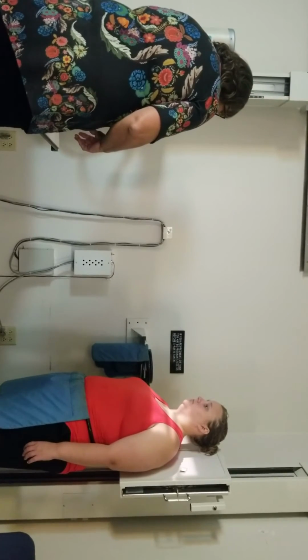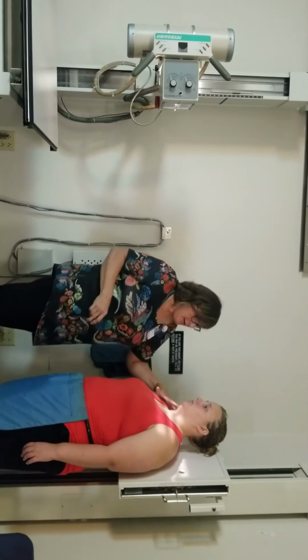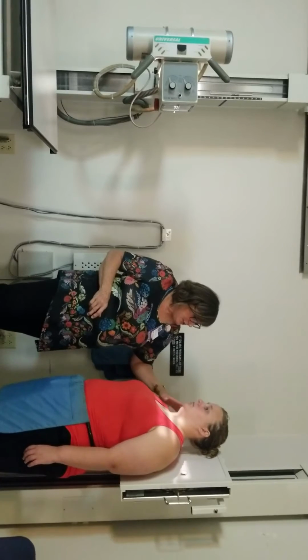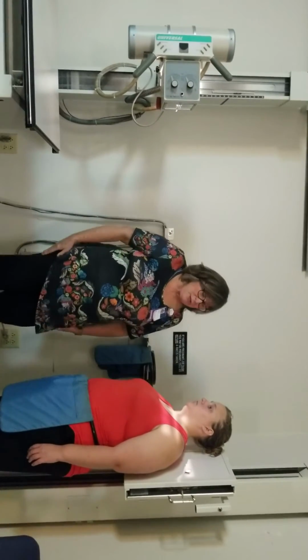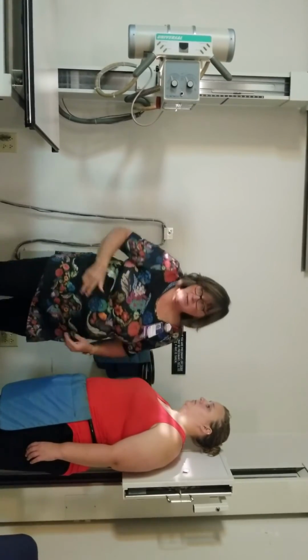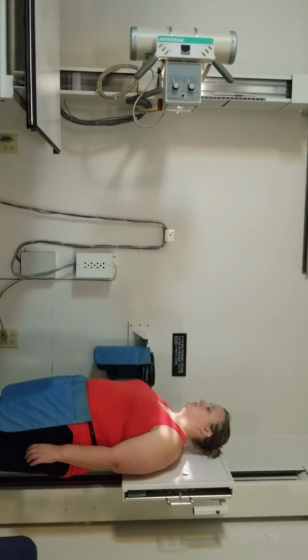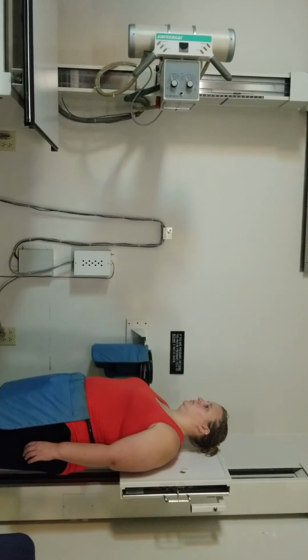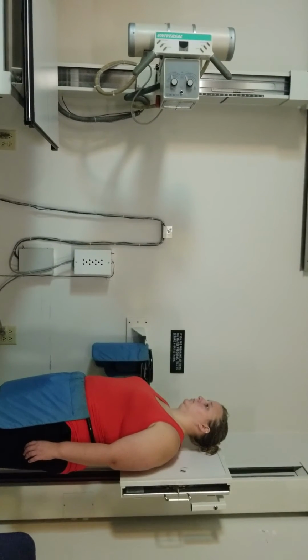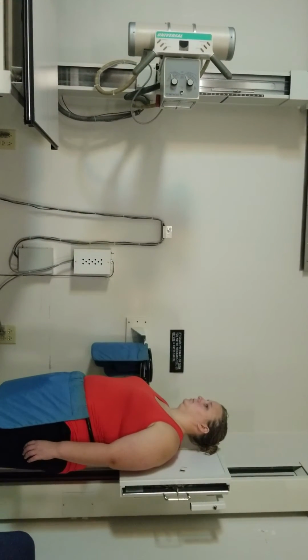I'm going to collimate to, what do you guys say? This is about a 5 to 6 inch in length. So I have our AC joint, I have my markers on, her hands are in a neutral position. I have her centered in the middle of my film, both joints are on. I'm going to double my mass. And Ellen, I need you to hold still, hold your breath, don't breathe. Good, you can breathe. I'm going to change my film out.